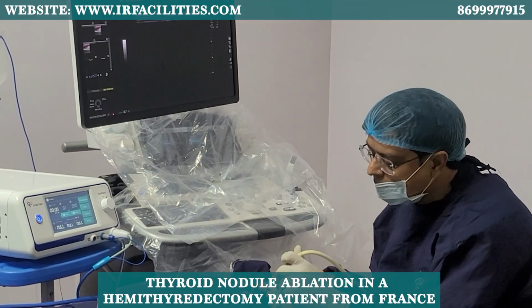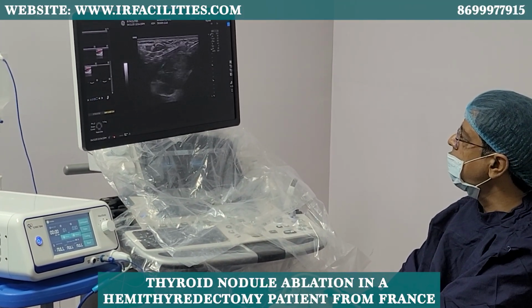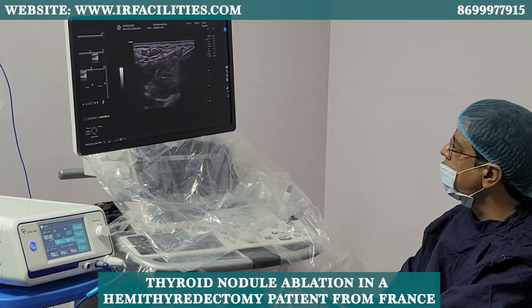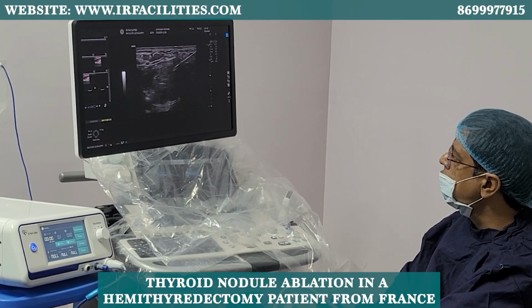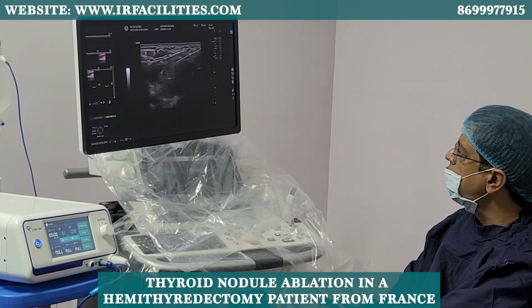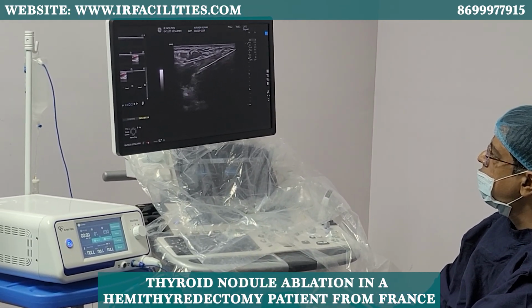Cord, the attachment cord needs to be removed, and the focus really is on. Yeah, that's the lesion. Yeah, and just getting.